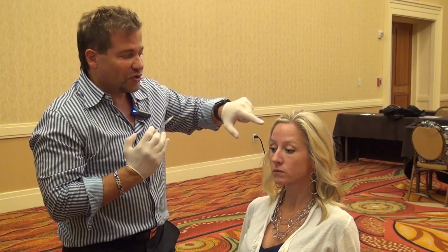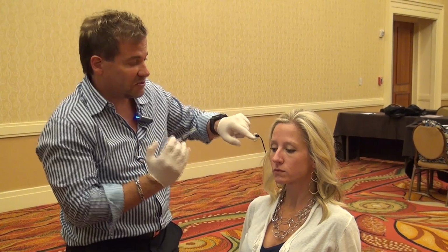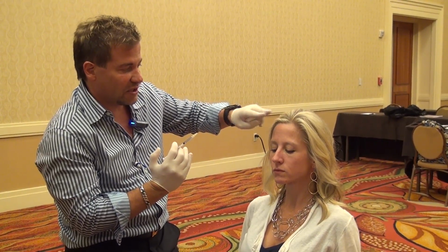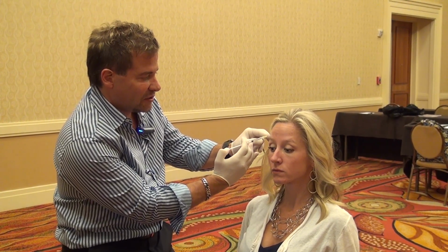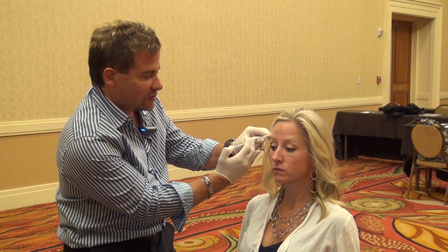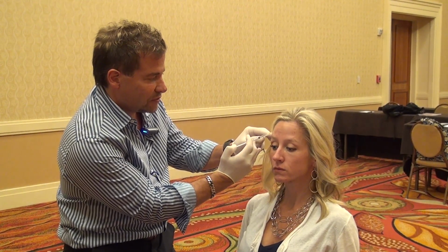When somebody doesn't really have many lines to begin with, you have to try to accentuate it so you can see the lines better. So I usually ask them to bring their forehead up like that and to leave it like that. And then just start over here. Okay, and then do 2 units there, and you're going right across.